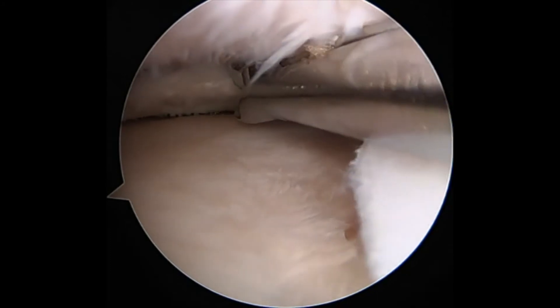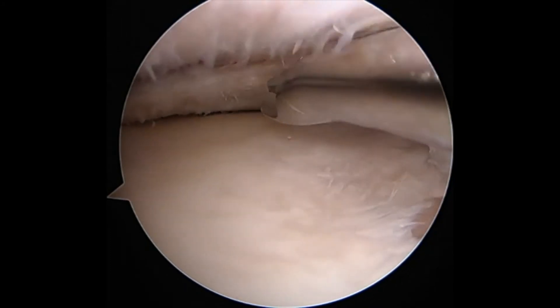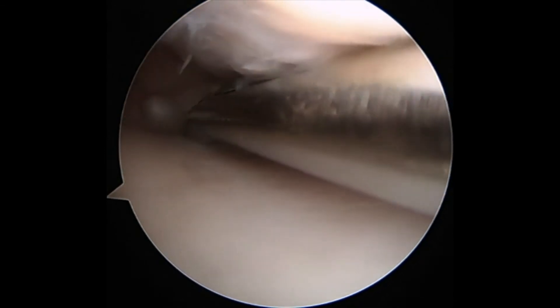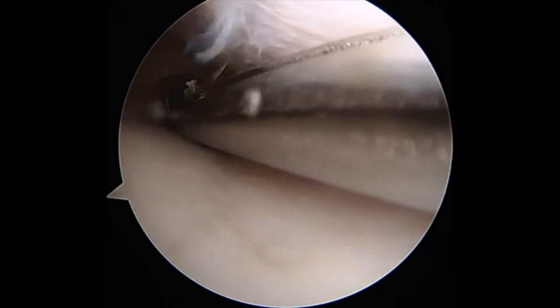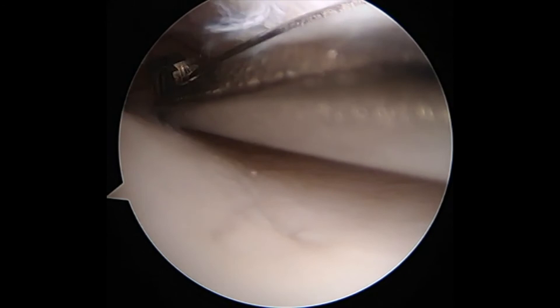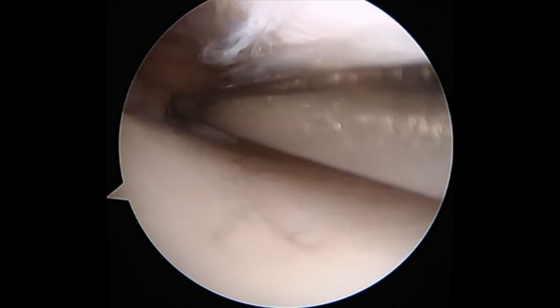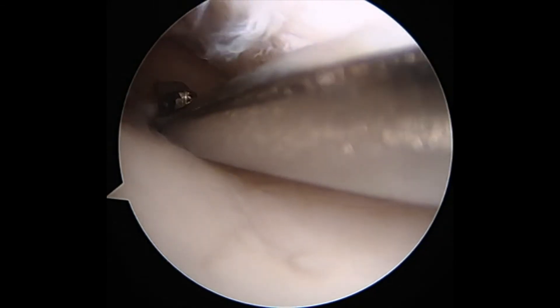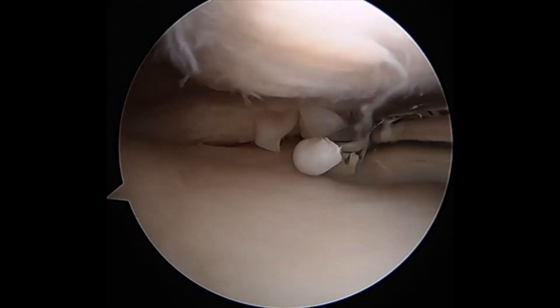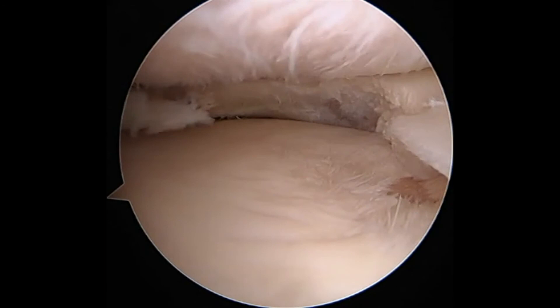Following this, I use a meniscal biter in order to remove the free ends of the tear. As you can see, the biter progresses along the tear to remove any loose edges. An analogy I like to use with my patients is that a meniscus tear is like having a pebble in your shoe. Any irregularity in the meniscus can cause extreme irritation in the joint, analogous to how a small pebble can feel very uncomfortable on the bottom of the foot.